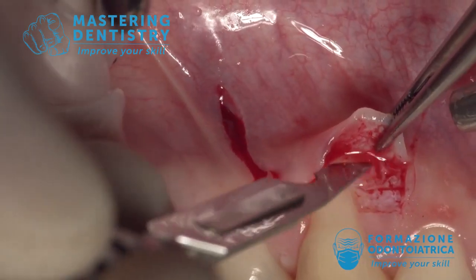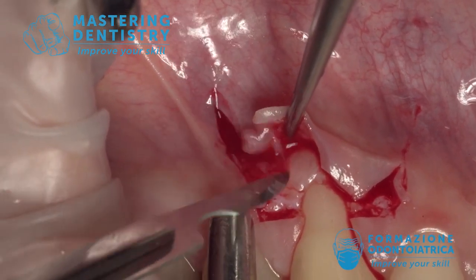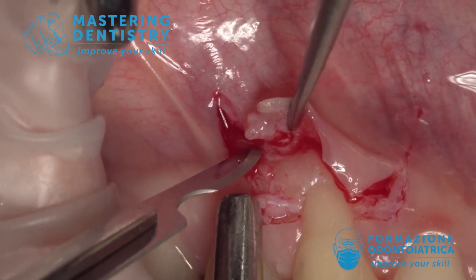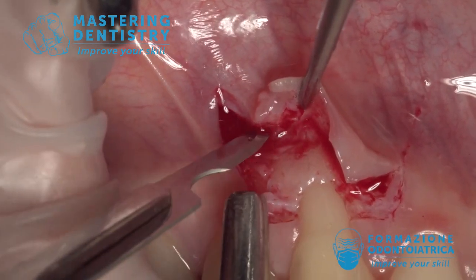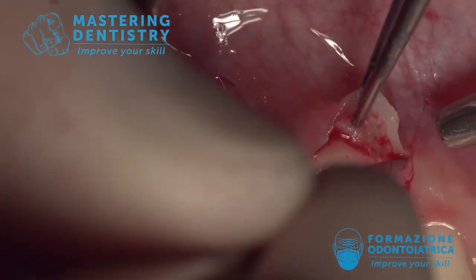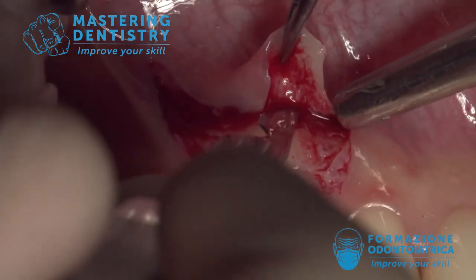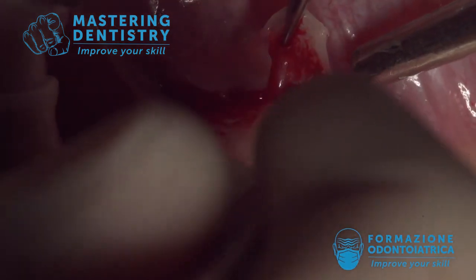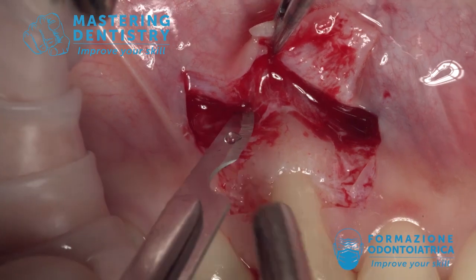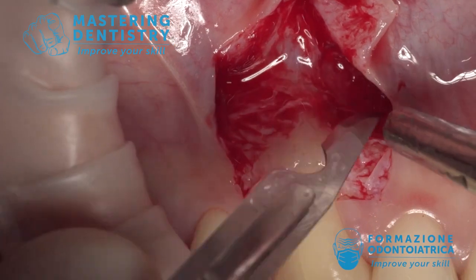Now I must go on with the blade cutting the deep muscular insertions. Remember the mimic muscle — we cut the deep muscular insertions holding the blade parallel to the bone and sliding on the bone surface, checking everything from underneath. You keep the flap elevated with the surgical tweezers and cut all the muscular insertions from the bone, leaving the periosteum there.